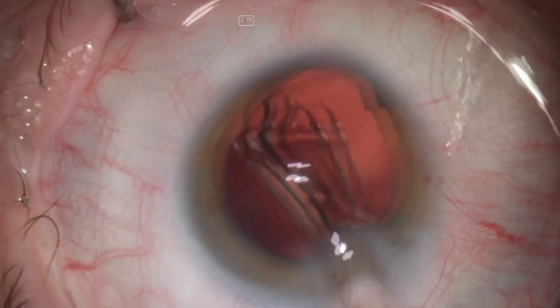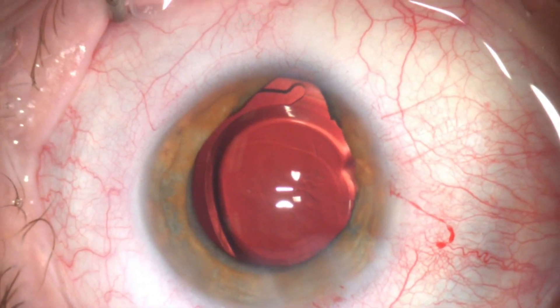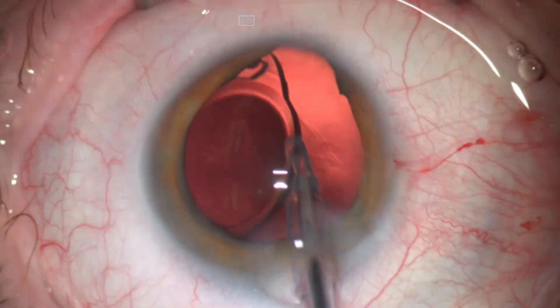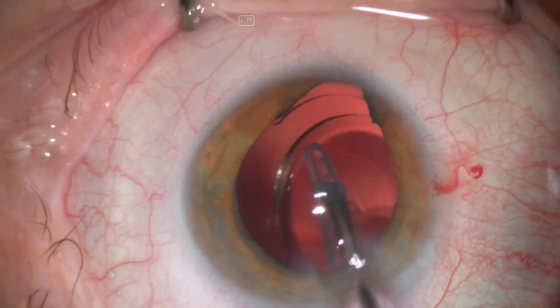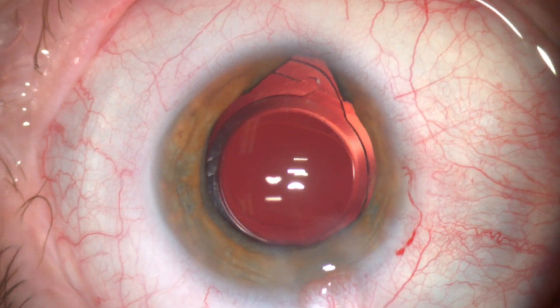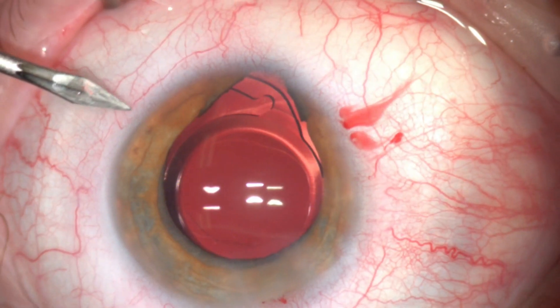This is followed by a foldable lens implant in the bag. At this point I prefer to remove any viscoelastic behind the IOL, as it will be challenging to remove later on after the iris repair. After removing the viscoelastic behind the IOL, I placed a little viscoelastic in front of the IOL and a bit of intracameral miochol to constrict the pupil.